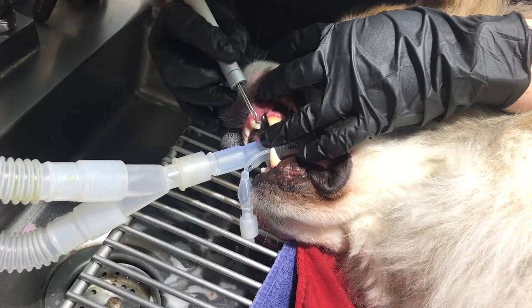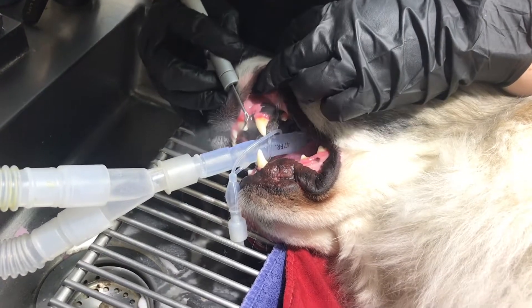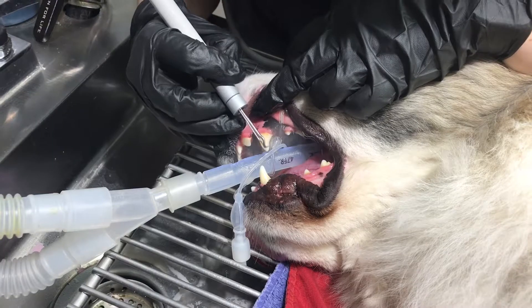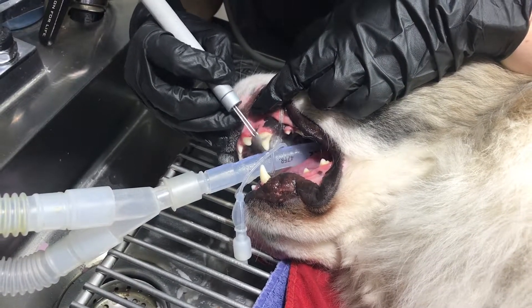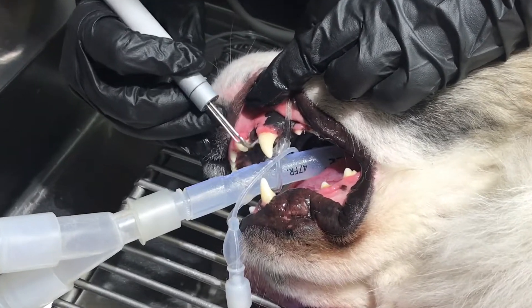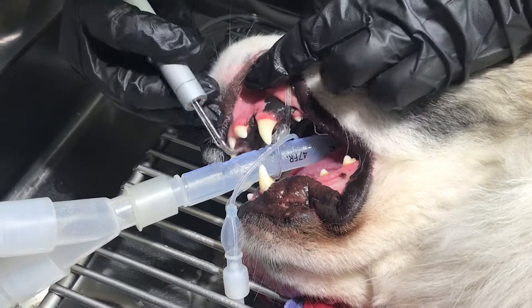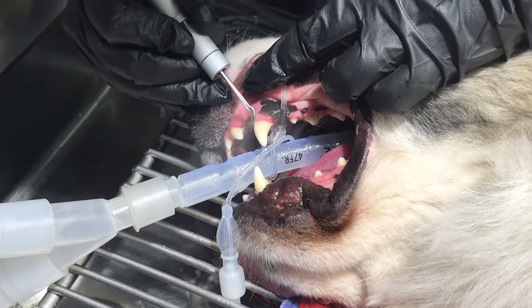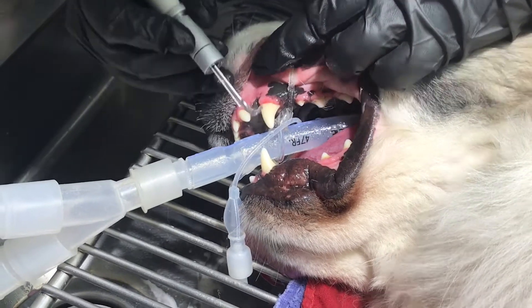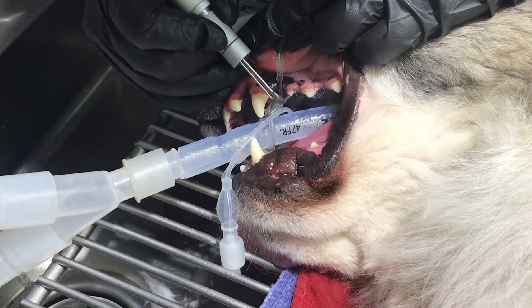What she's using now is called an ultrasonic scaler. It's using sound waves — you can probably hear it, it sounds like nails on a chalkboard. Essentially, it's using little sound waves and vibrations to break up the tartar. It's a rapid way to break up really dense deposits like tartar, and we can move through these dogs pretty quickly. Especially the bigger dogs, we use the ultrasonic on.